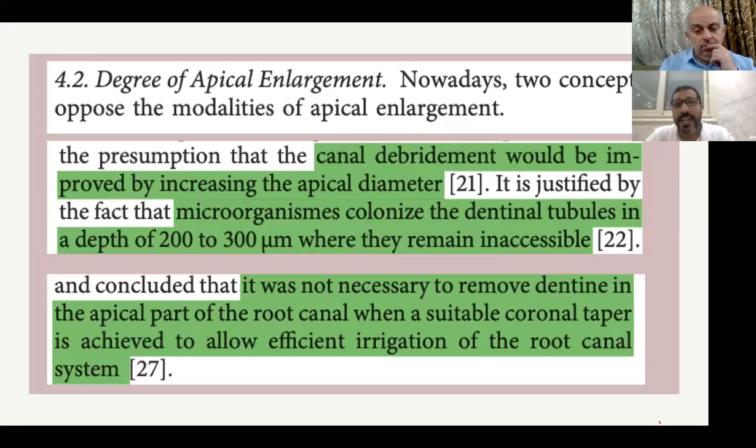Which technique is suitable for this case? In such cases, when your initial file is size 8, it is sufficient to do an apical preparation up to size 25 file. While in other cases, if you have an initial file size 25, it is not sufficient to prepare the apical size to size 30, but you have to enlarge the apical size. All of these schools should be supported by the concept of cleaning of the root canal system. Both of them are right, but without cleaning of the root canal system, there is no role for them.